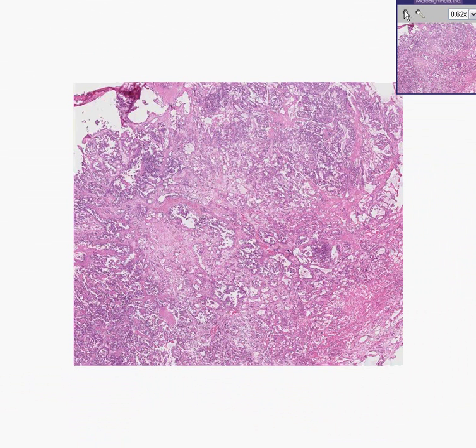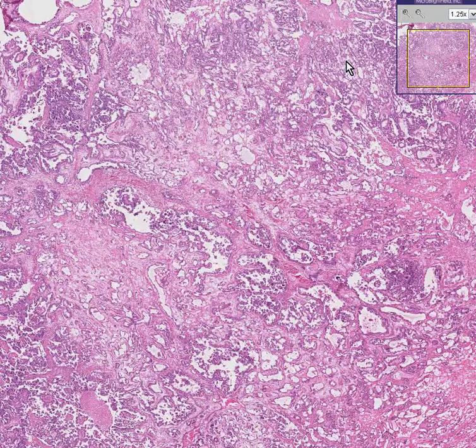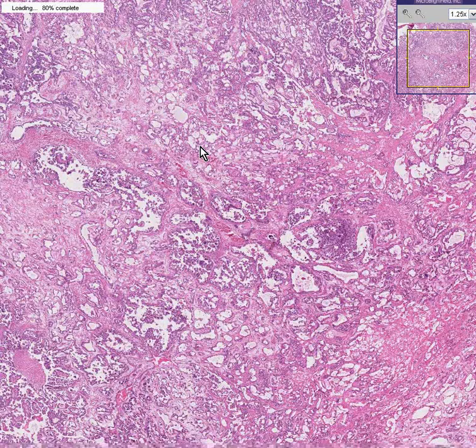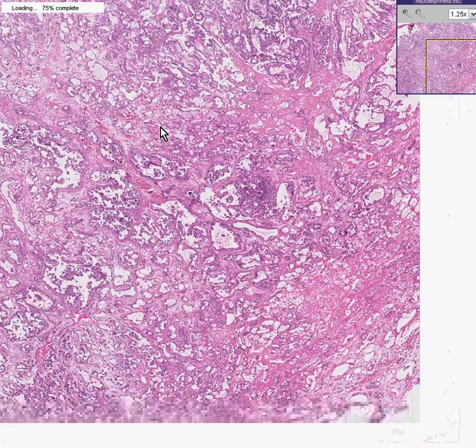If I told you this was a testicle, you would have every reason not to believe me, because you don't see anything that looks like normal testis. You don't see seminiferous tubules. You don't see interstitial cells. You don't see Leydig cells.